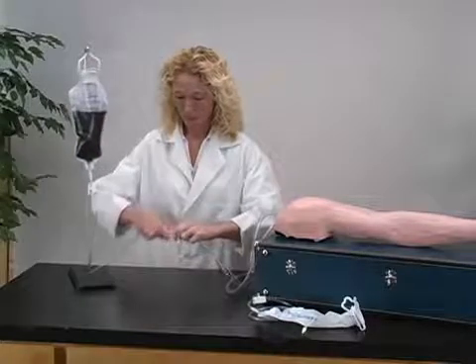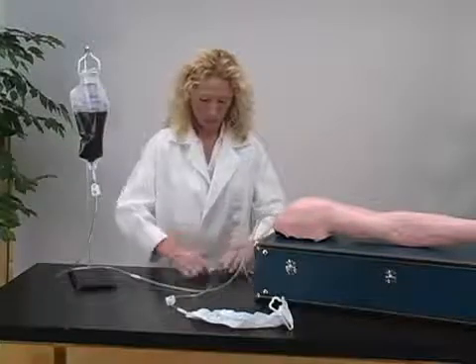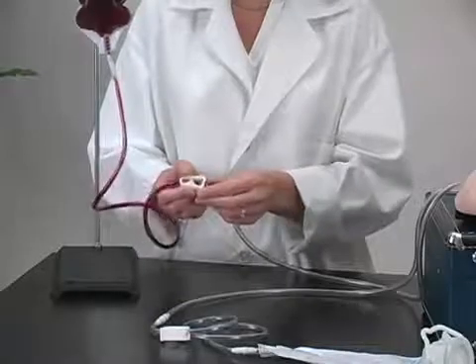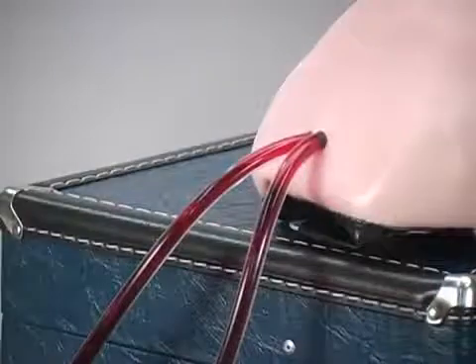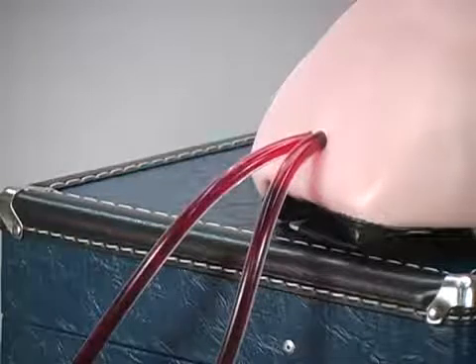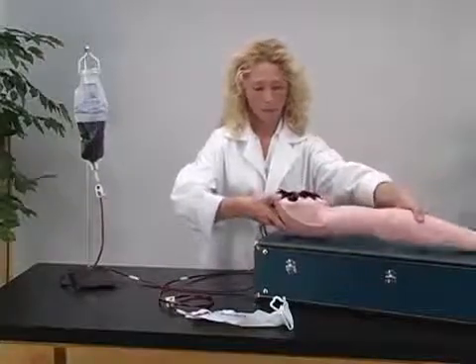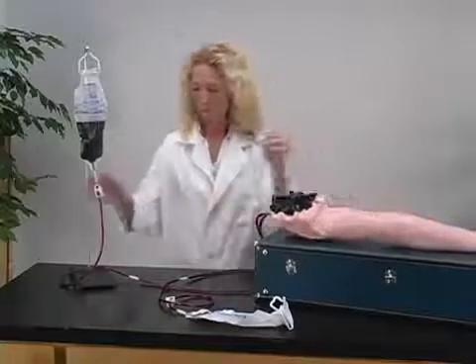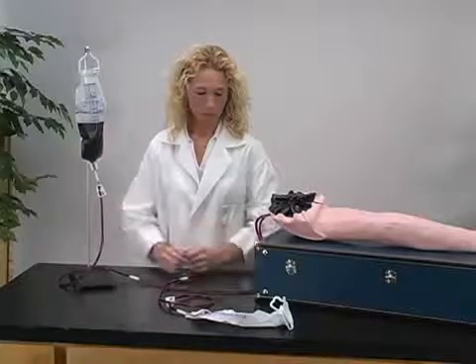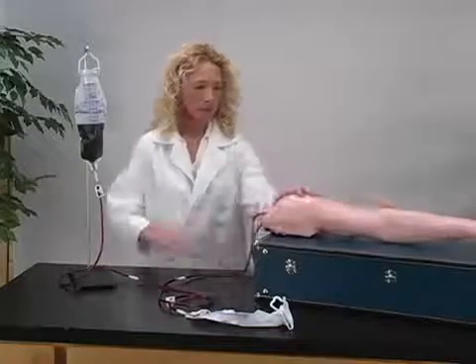Attach the arm tube to the top IV bag, and attach the other arm tube to the bottom IV bag. Now loosen the clamp on the top bag and blood will begin to flow through the arm. Once the air bubbles stop appearing, close the tube again. Turn the arm over and release the clamp. Once the air bubbles have stopped, close the top clamp. Your IV arm is now fully pressurized and ready for training.